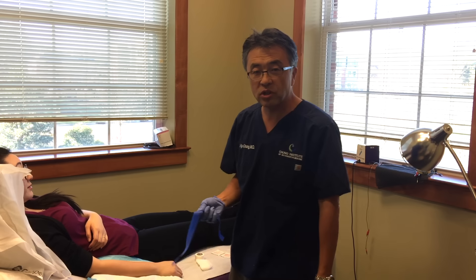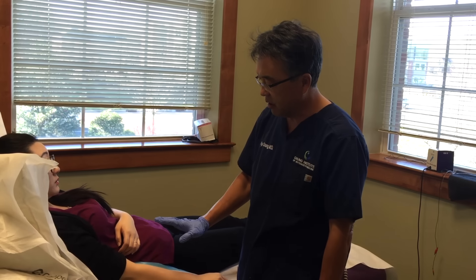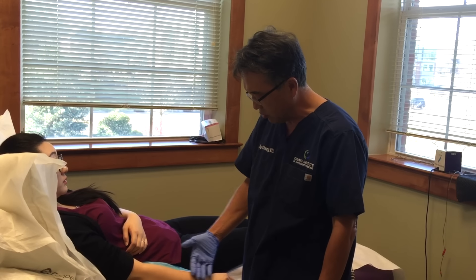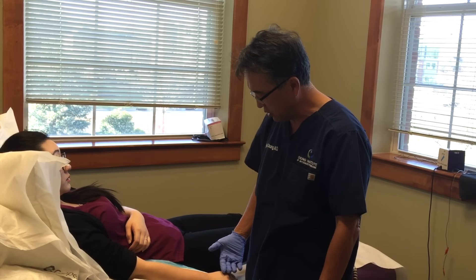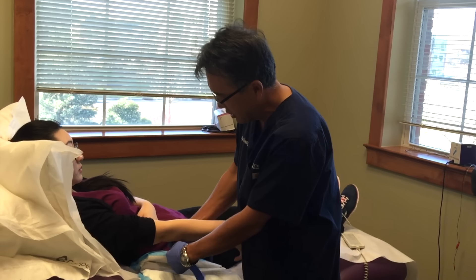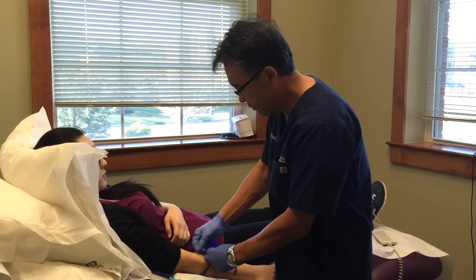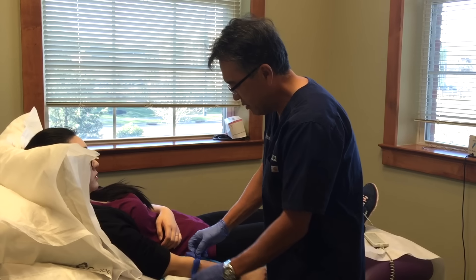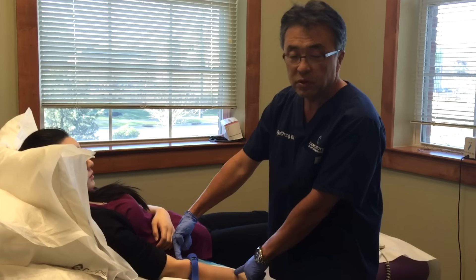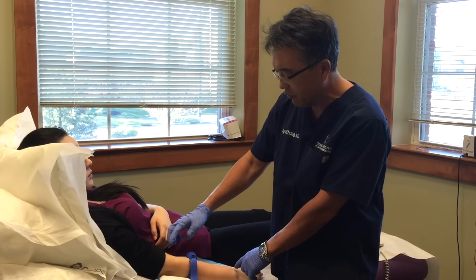I'd like to now demonstrate how to put in the IV. Ideally, when you put the IV in, if the upper body is raised at an angle, it puts greater venous pressure and the veins stand out a little more. That's why I have her lying down but raised a little on the upper part. If an IV is to be placed for a long time, this area is the best place because the patient can still move their wrists and forearm.